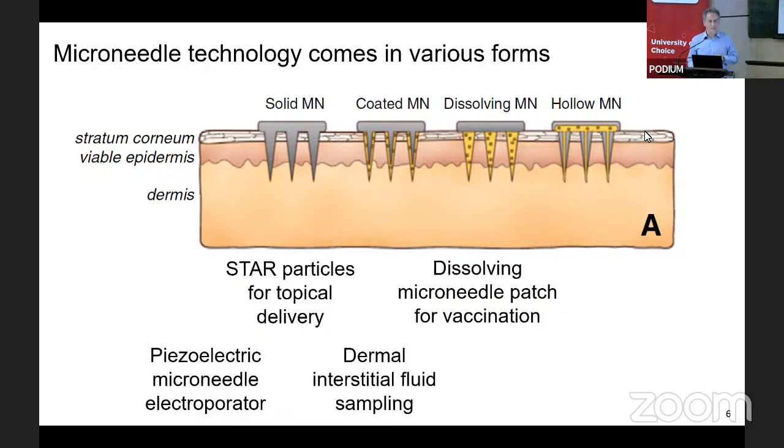Another approach, again using the solid microneedle, is using the microneedles in reverse. So we are making pores in the skin, but pulling fluid out of the body rather than putting drugs in. And I'll try to describe to you why accessing that interstitial fluid may be of interest.